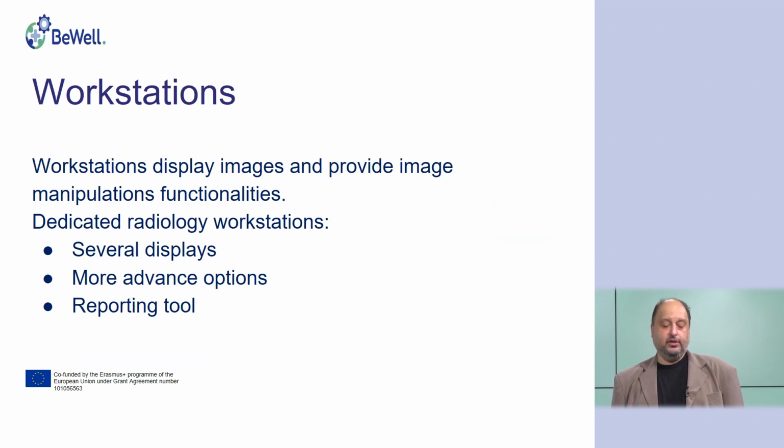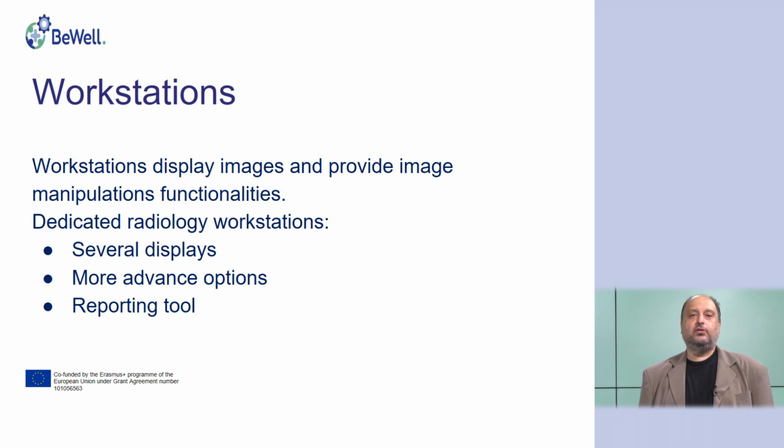The workstations, there are several types. They display images and provide image manipulation facilities. As already explained, manipulation is not a bad thing in this case. This is just processing of the image to enlarge or to rotate or whatever. And there are dedicated radiologist workstations with many capabilities.